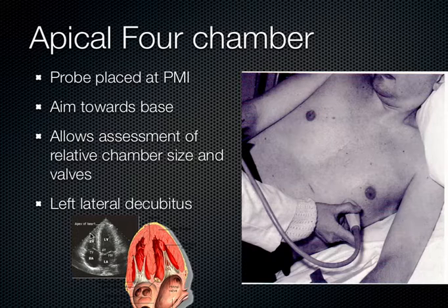And as the right ventricle gets bigger and bigger, there could be some problems there with the right ventricle trying to pump blood against an obstruction like a pulmonary embolism. And so in the setting of massive pulmonary embolism, or blood clot in the lung, the right ventricle gets so big it approximates the size of the left ventricle. So that's how I use this view clinically.